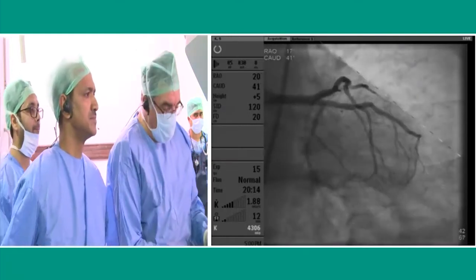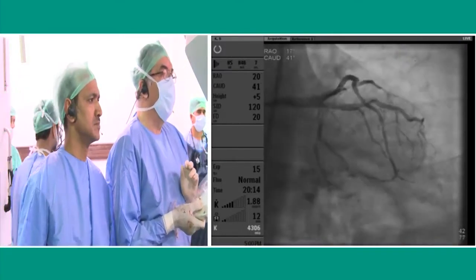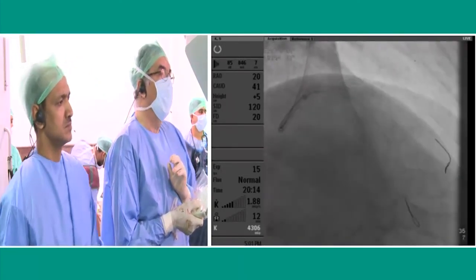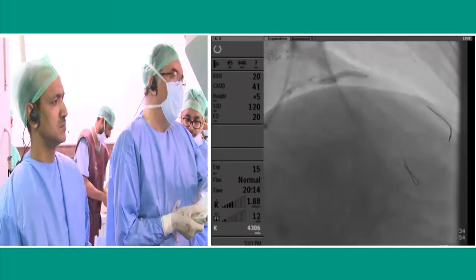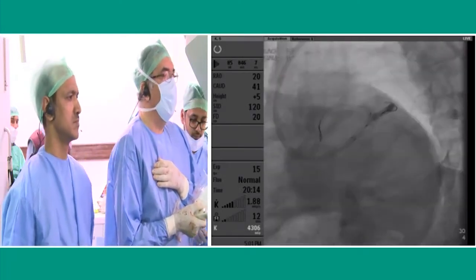If you didn't see the TAP, I will show you. You can come back. It's very important to see where is the placement of the stents. Here was the post-dilatation with the balloon more proximal, of course. And the TAP was done at that point here.